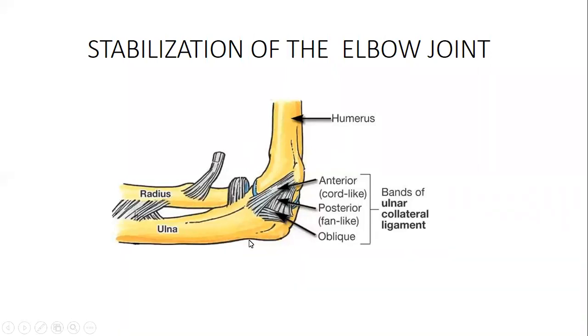You also realize that the medial portion, or the medial compartment, has other structures, which we can call the common flexor tendon. This common flexor tendon around the medial portion is very important clinically when a patient comes with an injury and is unable to flex their elbow joint. It must click, as a sonographer or radiographer, that there must be something happening within the medial compartment. Why? The medial compartment has the common flexor tendon, and it's always affected when it comes to pathologies.